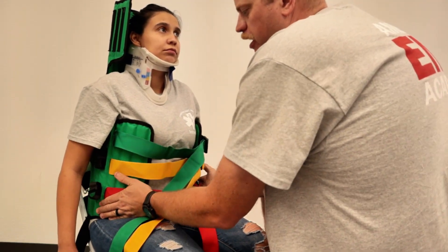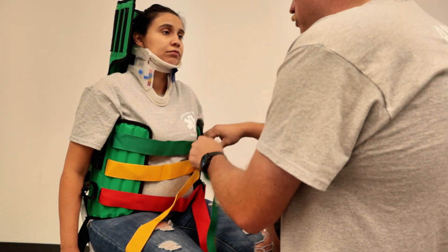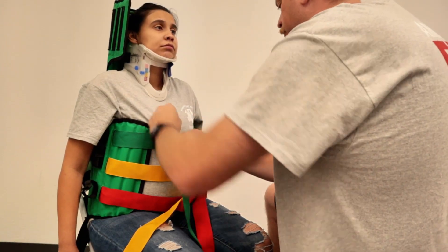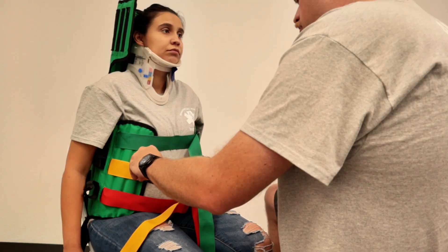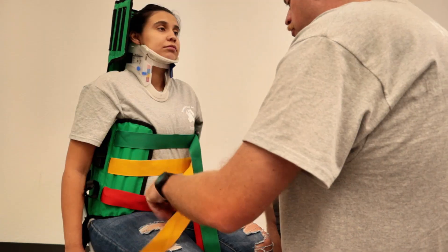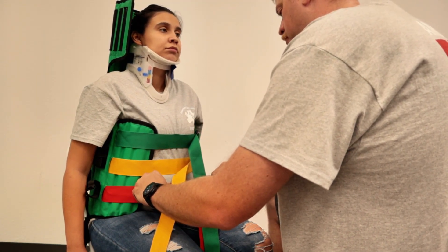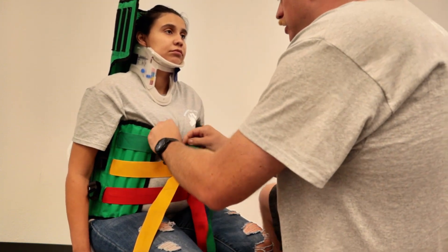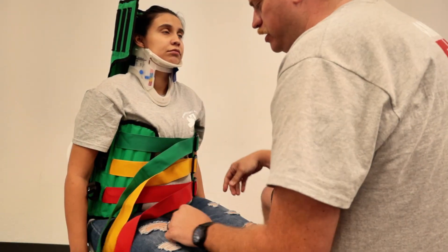Now that all three are tight, we can go ahead and start tensioning them more. Now I'm going to have her take a deep breath and hold it — okay, breathe out. Go ahead and take another deep breath and hold it — breathe out. One last time. Tighten it against a full breath so that they can make sure they've got a nice deep breath if they need to take deep breaths.